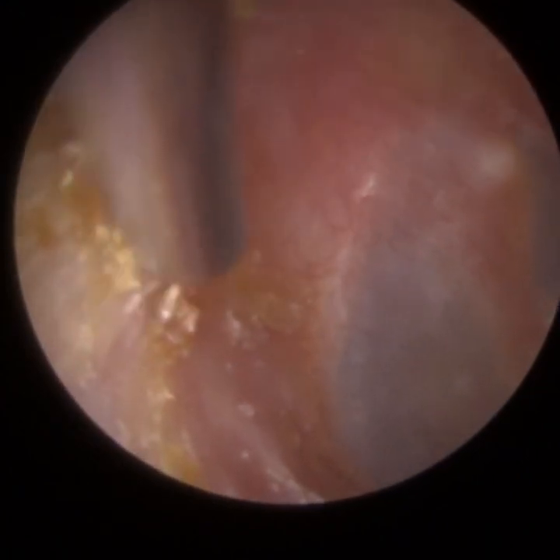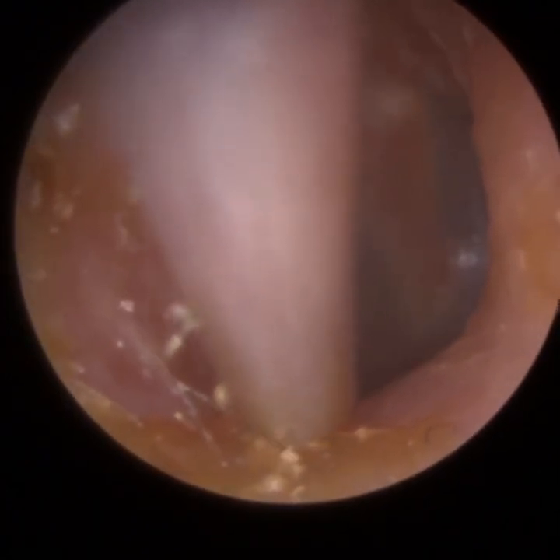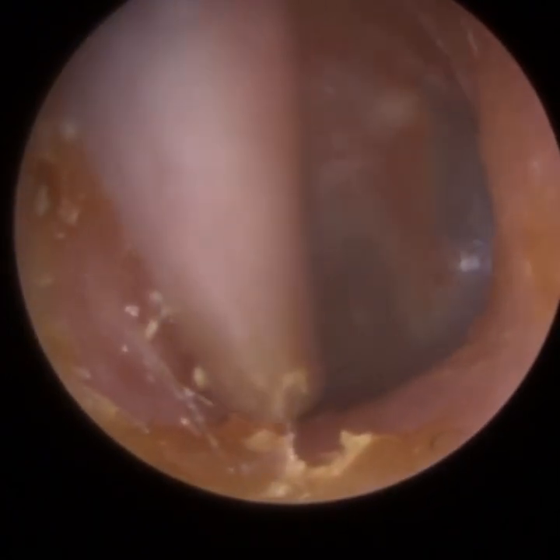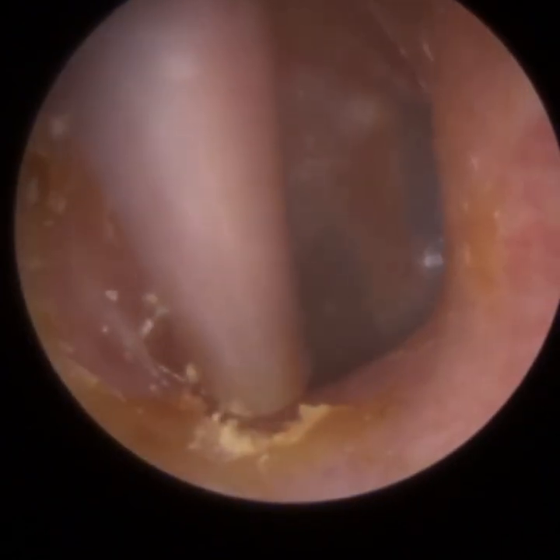I've given the patient a good slap on the wrist, and they're fully aware not to use the wrong domes on the wrong hearing aids, because this is what can potentially happen. No harm done long term anyway.